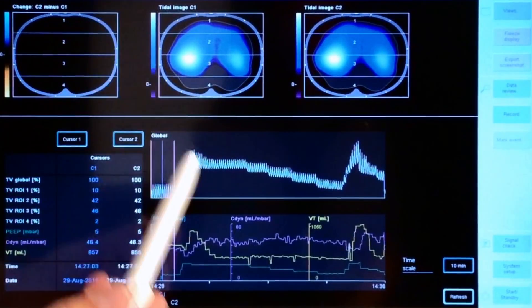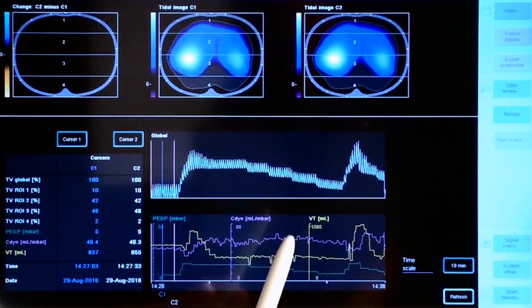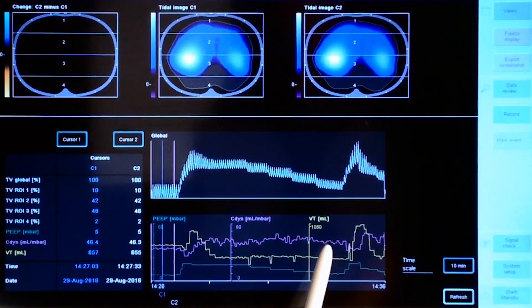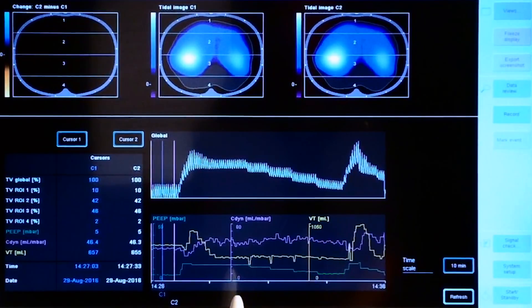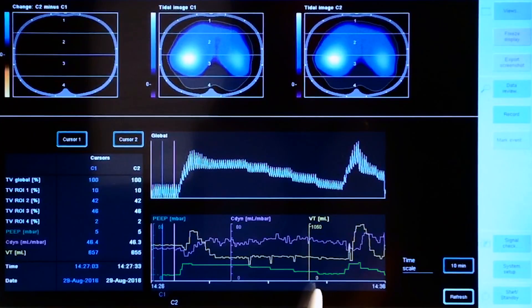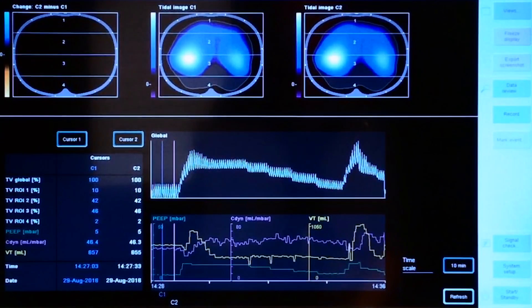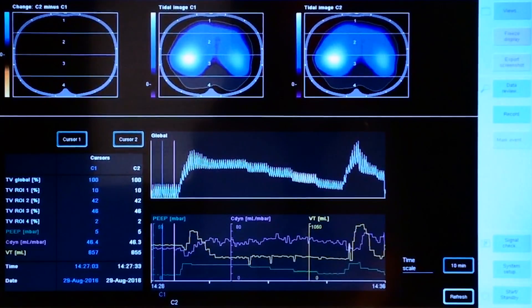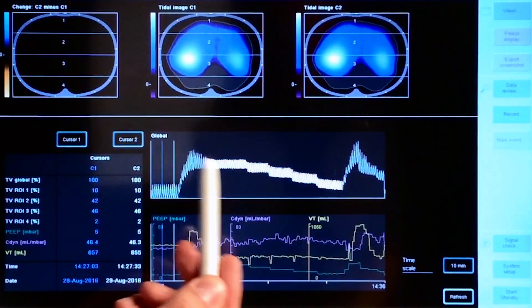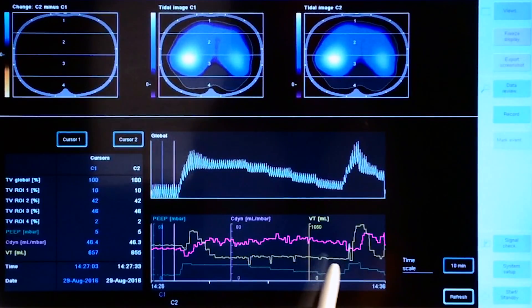According to the study protocol, PEEP was optimized based on global dynamic compliance from the ventilator. During the decremental PEEP trial, compliance shown in pink only drops at a PEEP level of 6. This is indicated by the green line representing the PEEP level. Therefore, a PEEP level of 8 was chosen as the best PEEP level. During the remaining steps, global compliance was more or less unchanged.